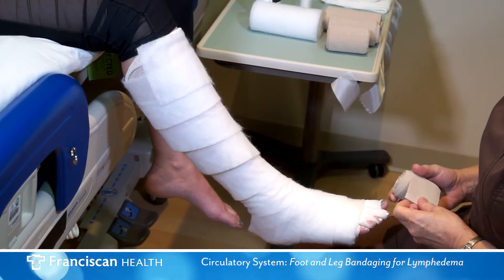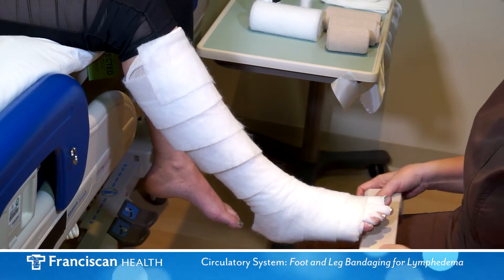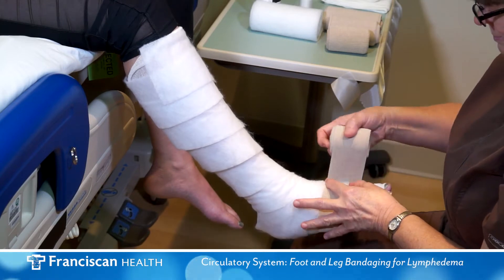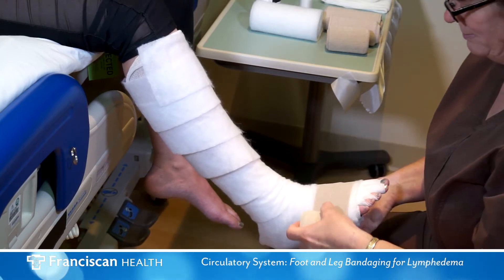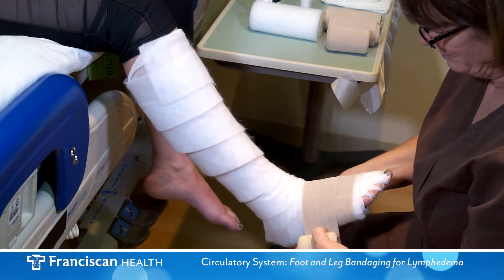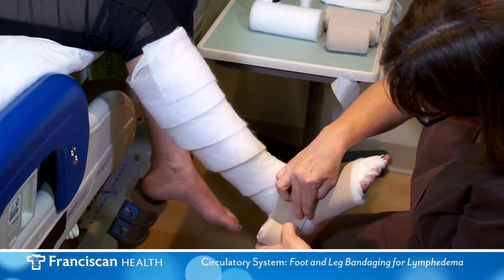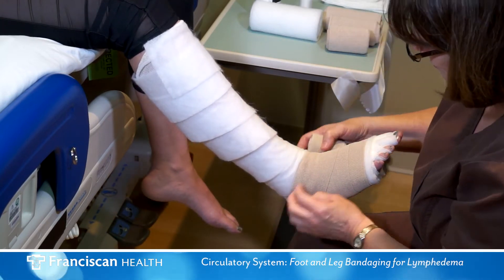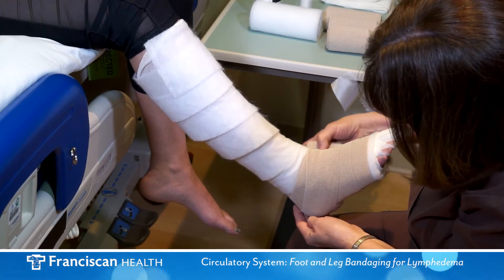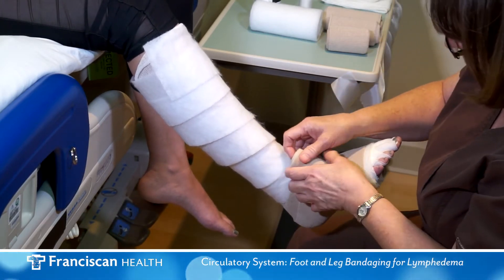The first compression bandage is the smallest. Start at the base of the toes. The foot should be held at a 90-degree angle while spiral wrapping around the foot, heel, and ankle. When wrapping with the brown bandage, overlap by 50% and stretch by 50% to maintain the appropriate pressure.